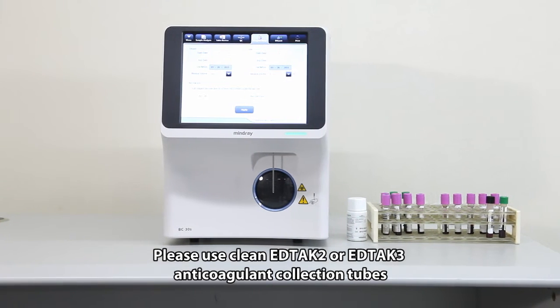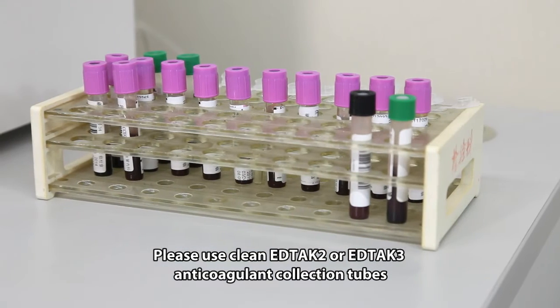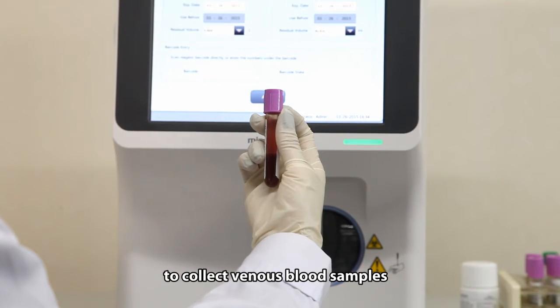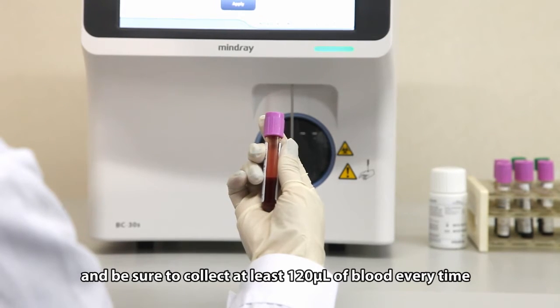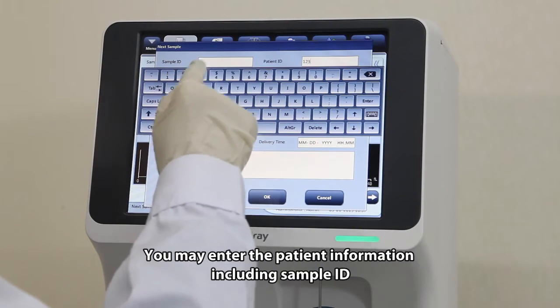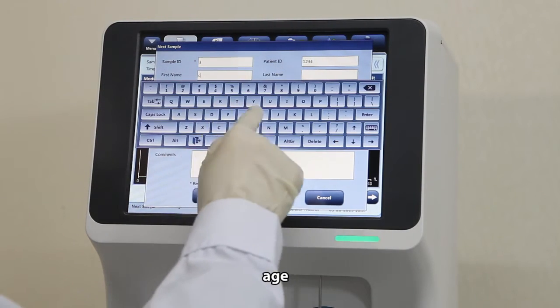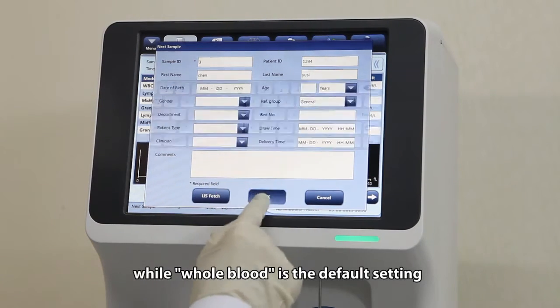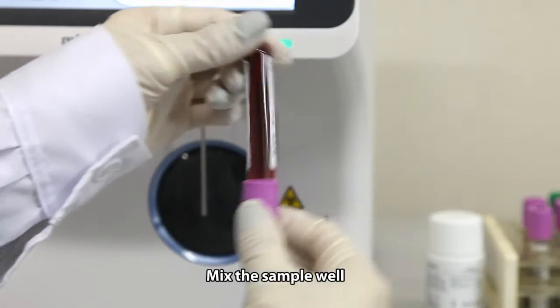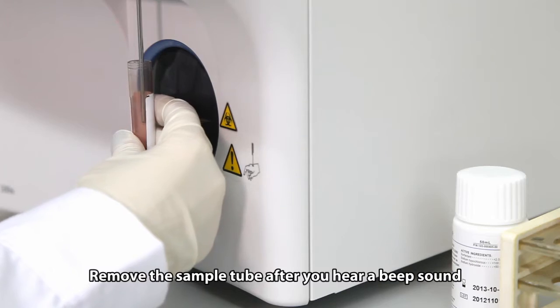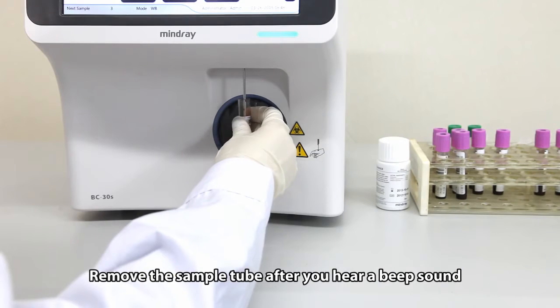Please use clean EDTAK-2 or EDTAK-3 anticoagulant collection tubes to collect venous blood samples and collect at least 120 microliters of blood every time. You may enter patient information including sample ID, name, age, gender, while whole blood is the default setting. Mix the sample well and run it through the sample probe. Remove the sample tube after you hear a beep sound.